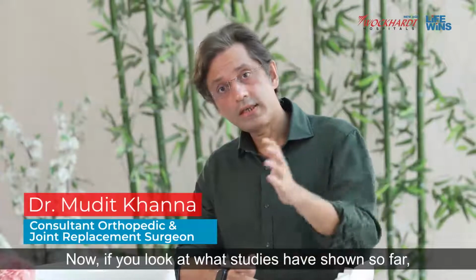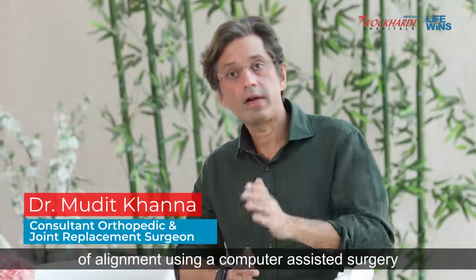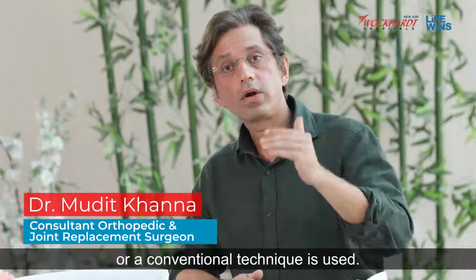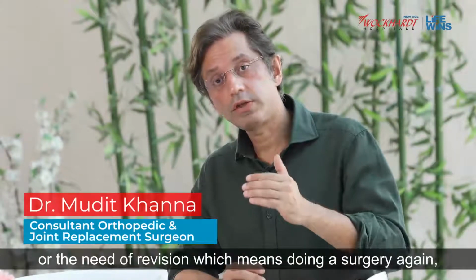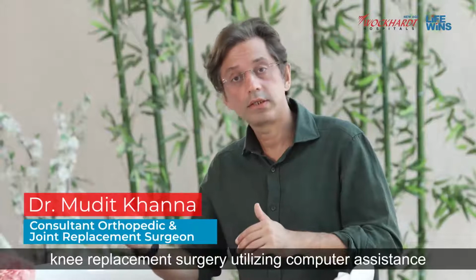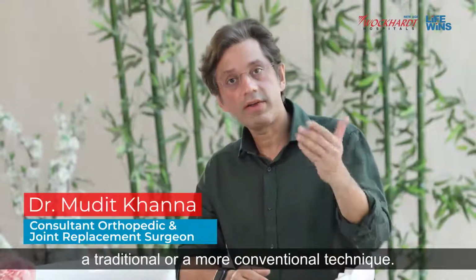If you look at what studies have shown so far, multiple studies have shown that the restoration of alignment using computer assisted surgery is far superior to restoration of alignment when a traditional or conventional technique is used. Also, more recent studies and publications have shown that the longevity of the implant, or the need for revision, which means doing a surgery again, is prolonged in patients who underwent knee replacement surgery utilizing computer assistance versus patients who underwent the surgery utilizing a traditional or more conventional technique.